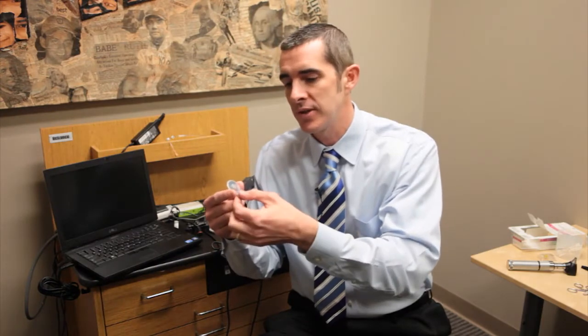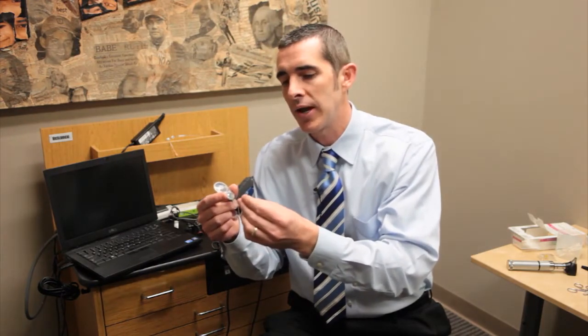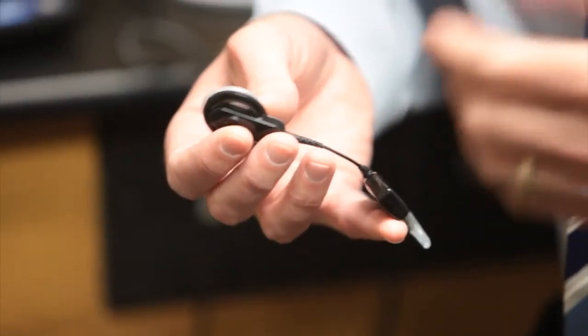There are two components to the implant. There's an antenna with a stimulator and then there's a tiny lead with an electrode array that's inserted into the inner ear, or the cochlea.